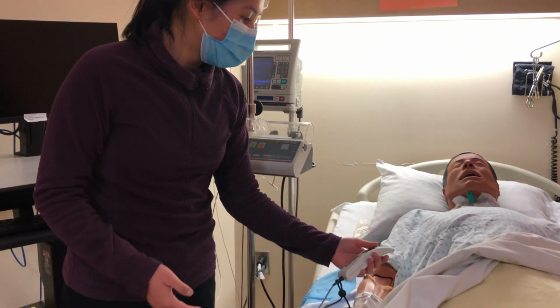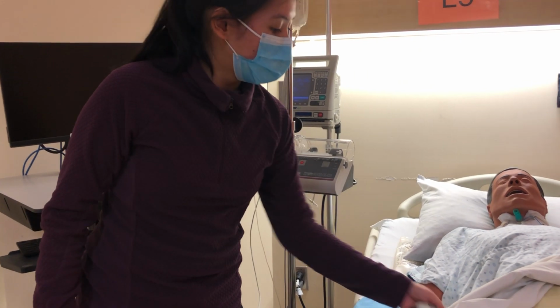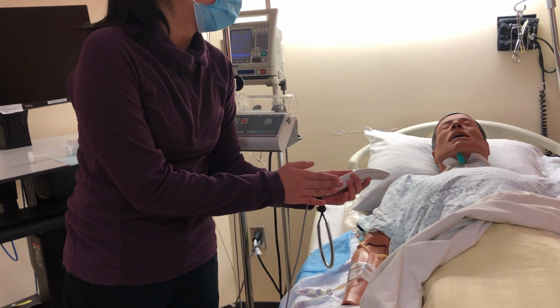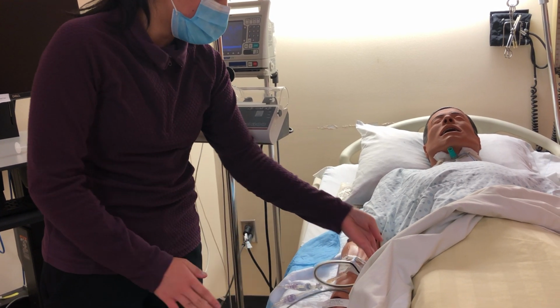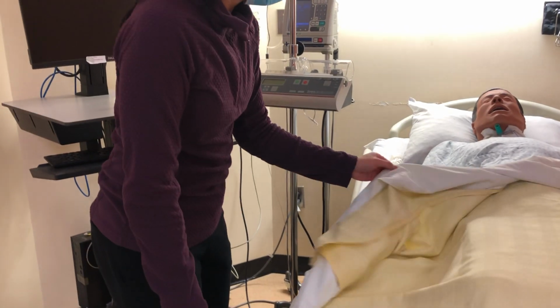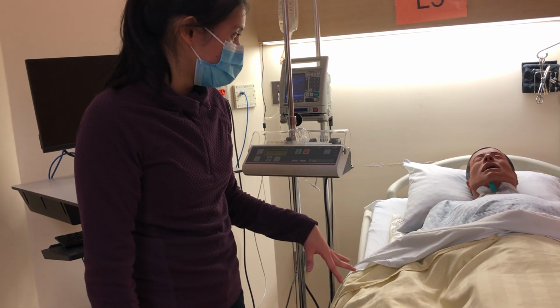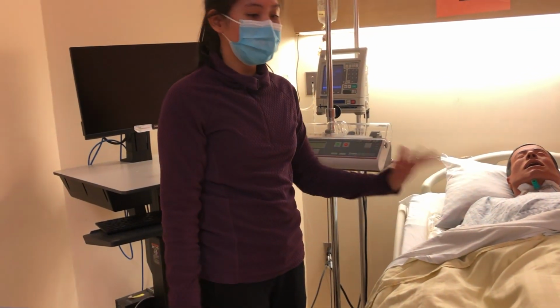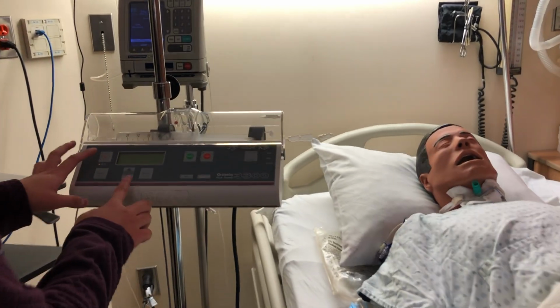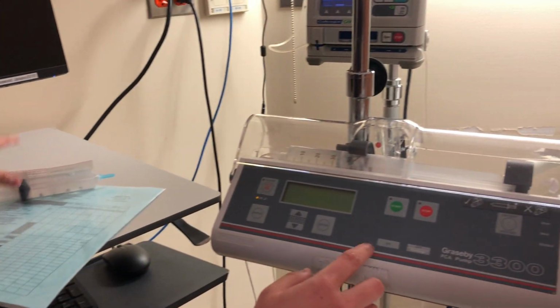And you have here your PCA button. For this one, we already educated you about this, but just so you know, you're the only one who can use it, not your family, not nurses, okay? Do you have any questions for me? No? Okay, and then can I give you this medication? Okay, so I've done my third check and patient education. Now we're ready to go over our pump here, compare it with our MAR and our final label here, so turn it on.